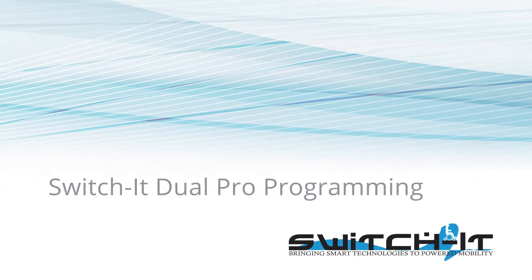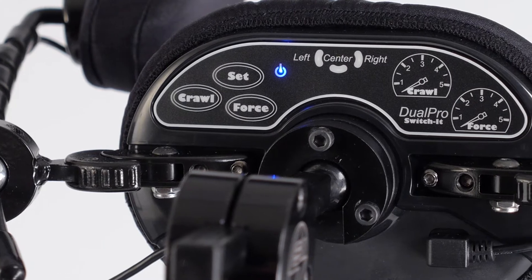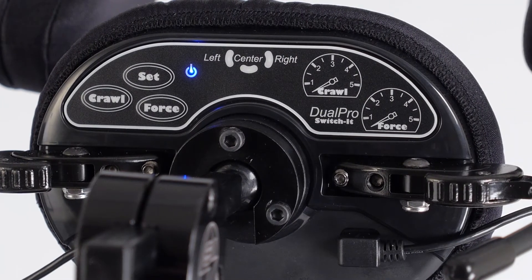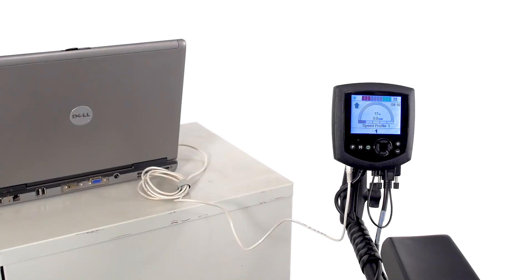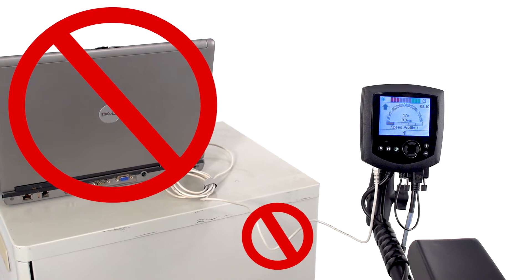Switchit Dual Pro Programming. Programming the Dual Pro Head Array takes place entirely on the backside of the center back pad. There is no need for a computer, programming interface, or any type of programming software.